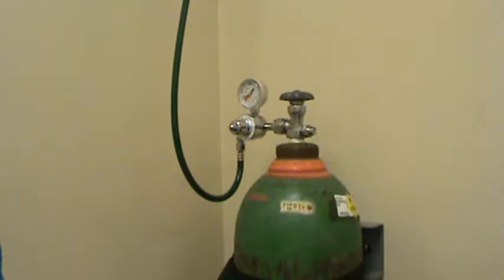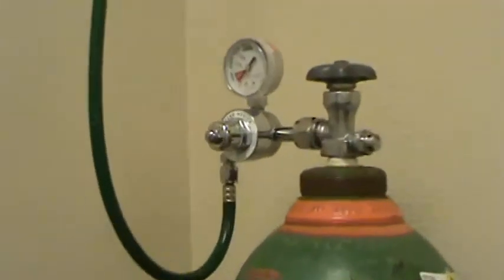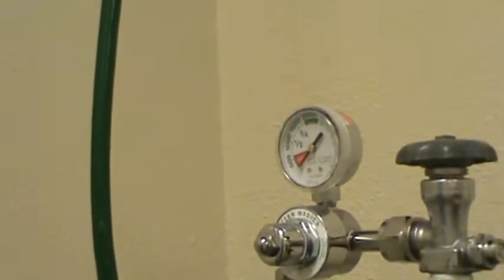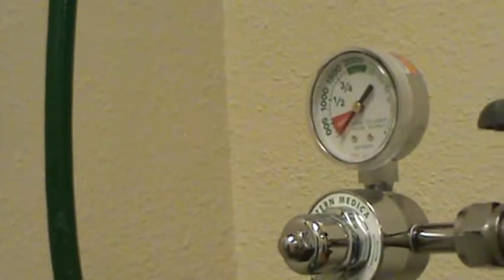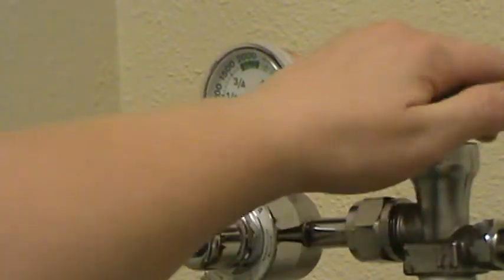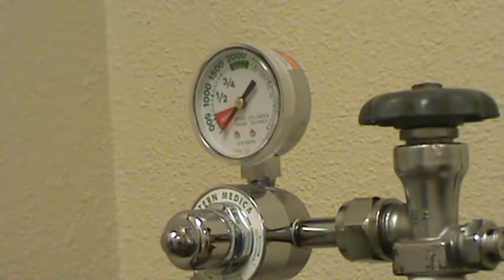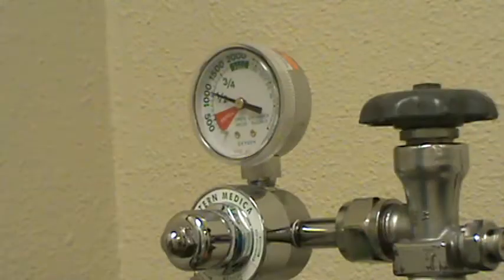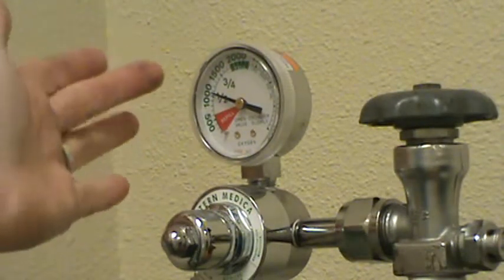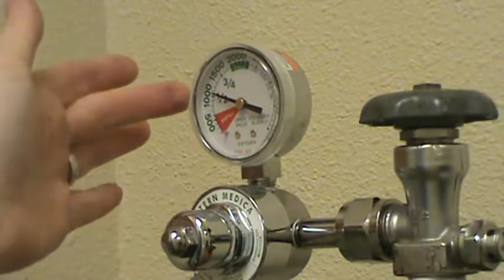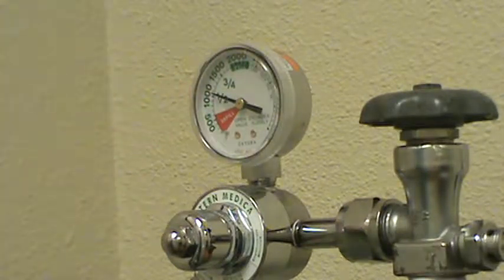We're going to zoom in here and show you how much oxygen we have. I'm going to turn this on. You can hear it filling. Perfect. Now that it's on all the way, we can see here that we have about a thousand pounds of oxygen. We have plenty enough for our procedure today.